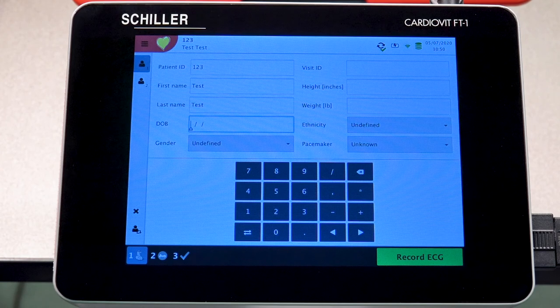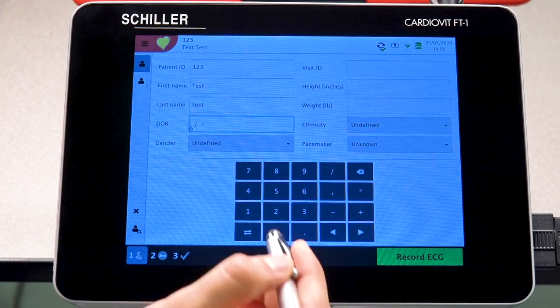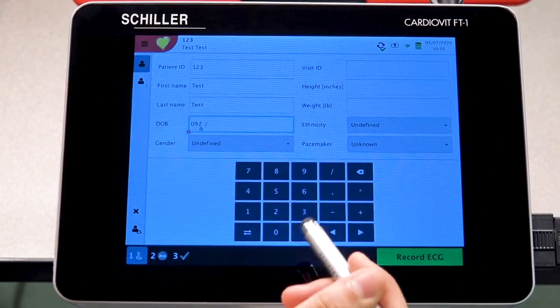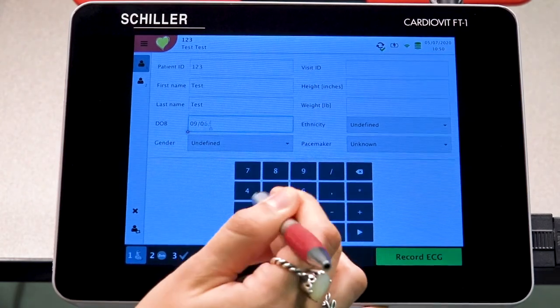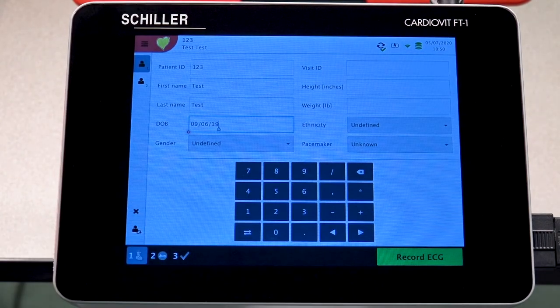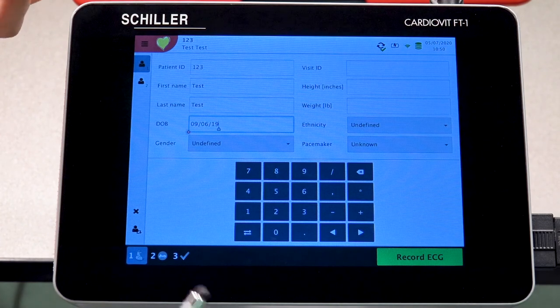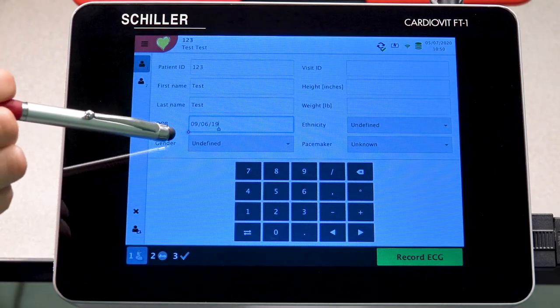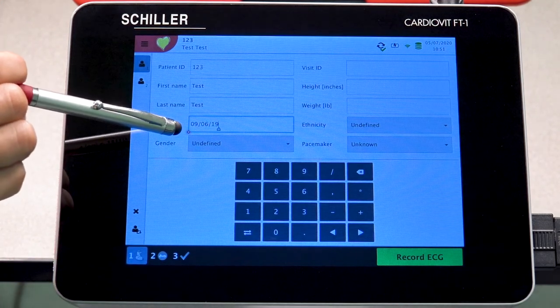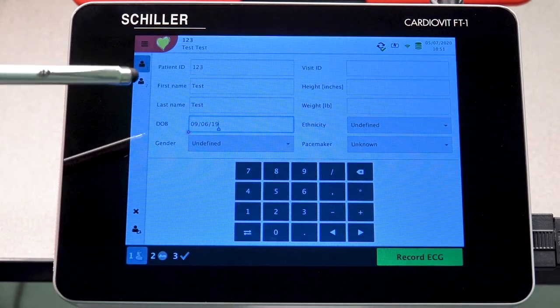With the date of birth, it is very important that you enter the correct format. Make sure you enter it as such. If you enter it incorrectly, you will get a little red X indicating that there's something wrong.